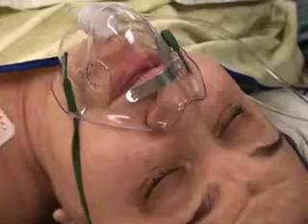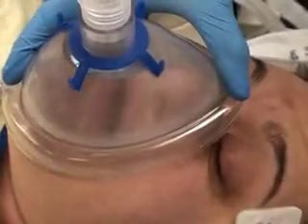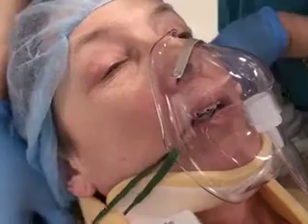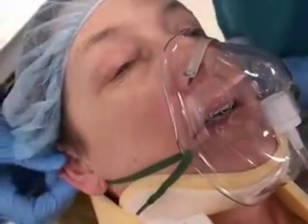Observe the face mask for the rhythmic condensation of exhaled breath. Phonation and speech after extubation are reassuring signs that vocal cord injury and acute glottic edema have largely been prevented. Continue to provide supplemental oxygen through the face mask until the patient has fully recovered.